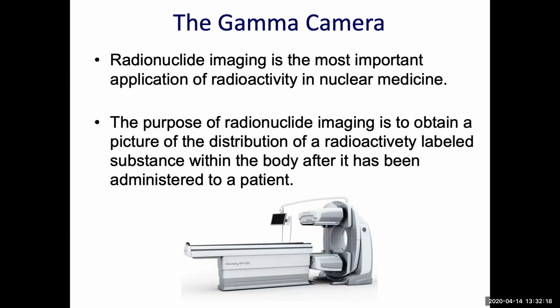The principles of nuclear medicine studies are based on the assessment of radioactivity distribution in a given organ after in vivo administration of a radiopharmaceutical, to distinguish between normal and abnormal tissue. Such assessment of radionuclide distribution inside the patient is performed by the gamma camera.